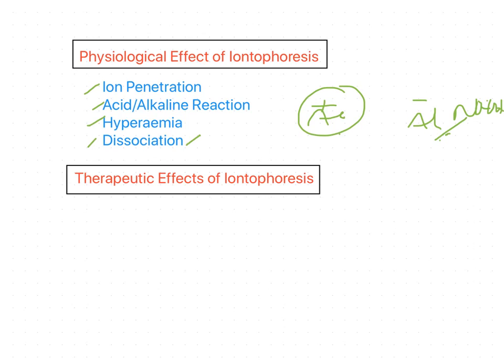The additional current-enhanced flow of electrons increases this normal migration and gives meaning to the concept of ion transfer, or iontophoresis. Because various tissues offer different resistance to current flow, electrode placement becomes a vital factor for iontophoresis.